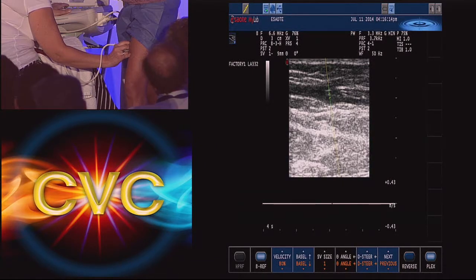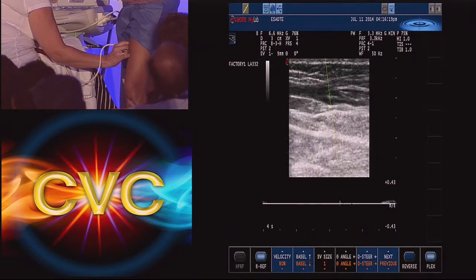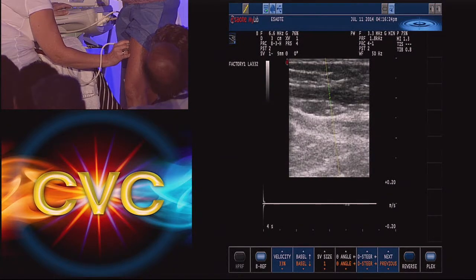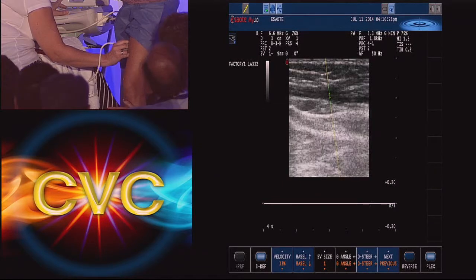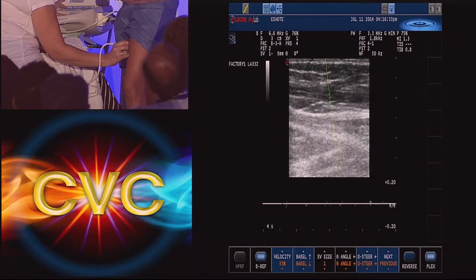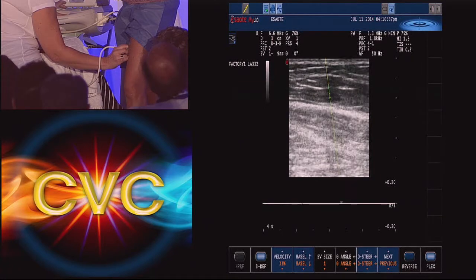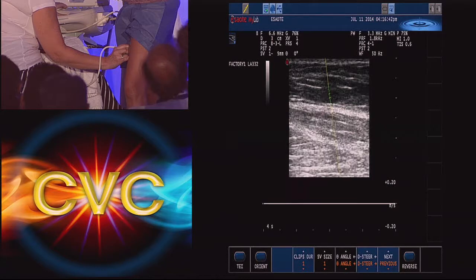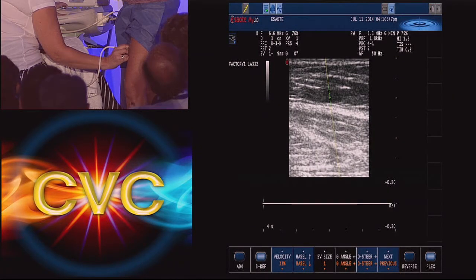Now you have to follow all the guidelines, which come from the literature. So venous insufficiency causes venous hypertension, which then causes varicose veins and all the other changes, whether it's an ulcer, et cetera. So you have to document venous insufficiency, and that is documented by documenting reflux. Less than 500 milliseconds is considered normal. So whether it's a perforator or a branch, you have to document how it goes up there.